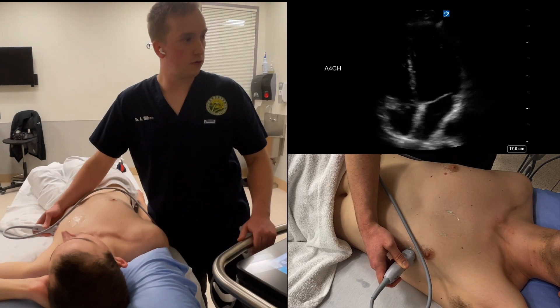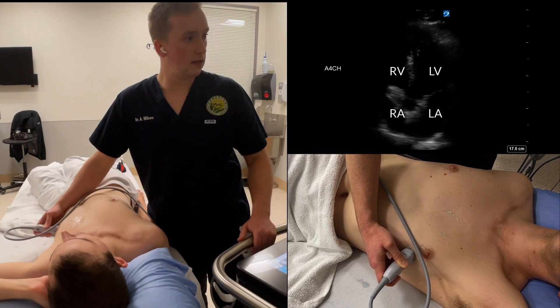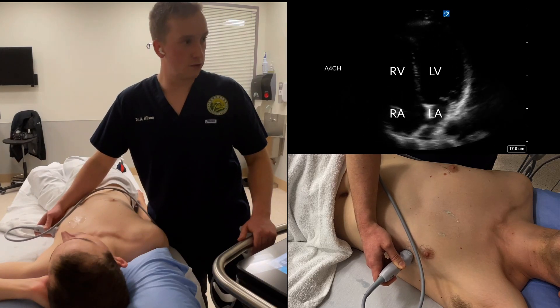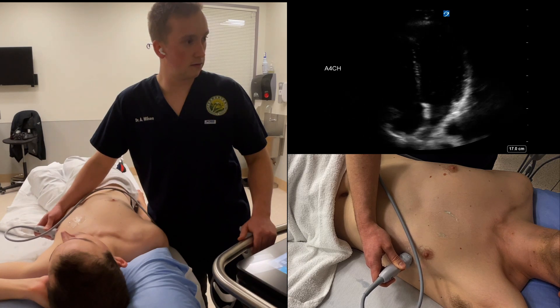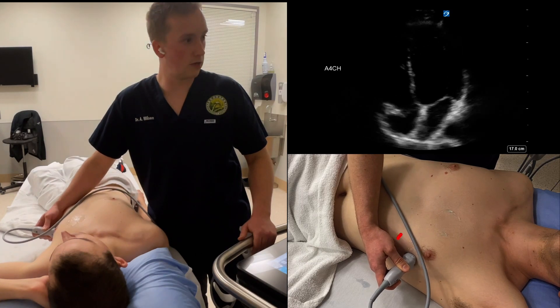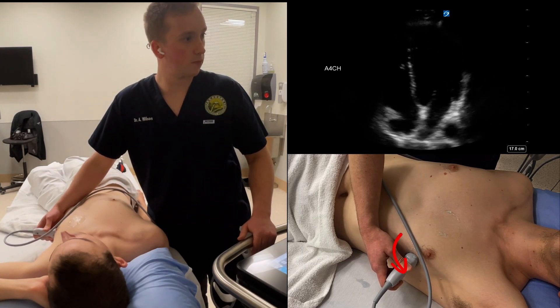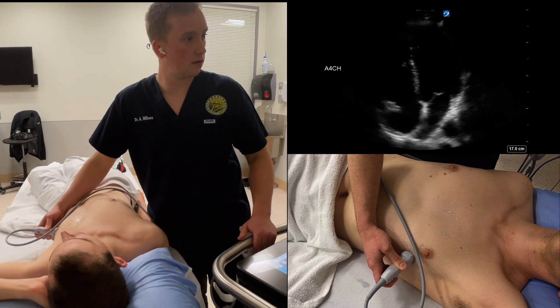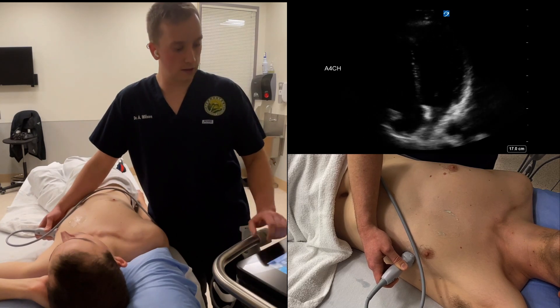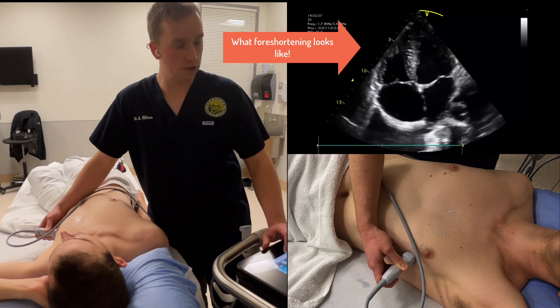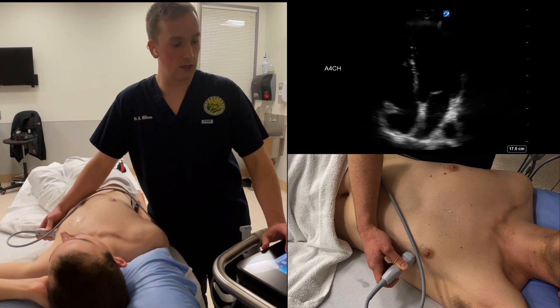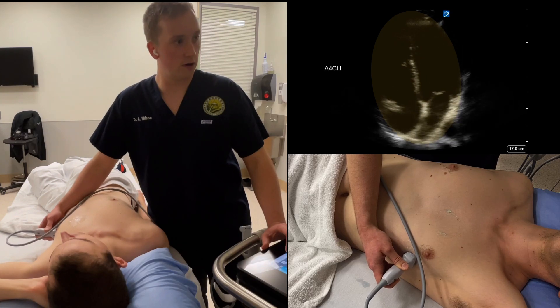Ideally, you should see all four chambers of the heart, including the mitral and tricuspid valve. You may need to make some movements to find these internal landmarks. Angling the probe towards the patient's right shoulder can often help with visualizing the four chambers. This is one of the more challenging views to obtain and it's prone to foreshortening, which can affect the accuracy of your image interpretation. A non-foreshortened apical four-chamber should show the heart in an oval or elongated shape, and it should not appear circular.